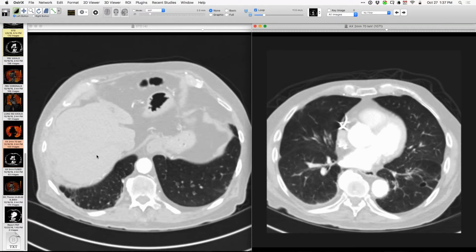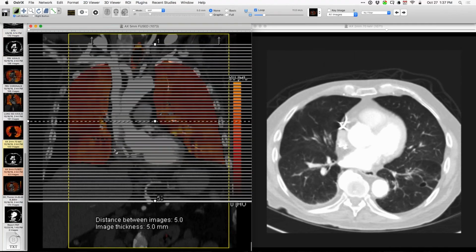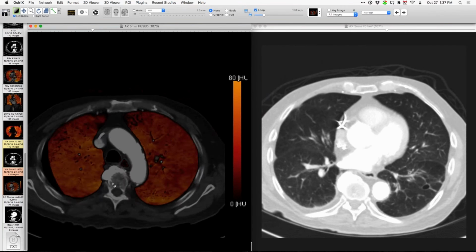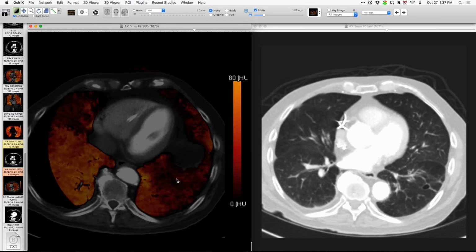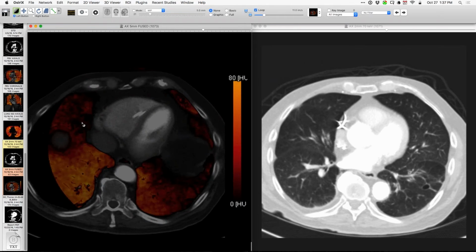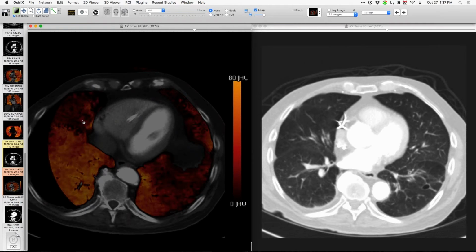And then this is something that Leif is doing quite a bit here. We're doing some pulmonary blood volume maps. So you'll see over here some blackness that corresponds quite nicely to the left lower lobe and a little bit to the right middle lobe. A nice example of non-resolution, non-fibrinolysis of clot in two locations and complete occlusion of those vessels. Nice example of that phenomenon.